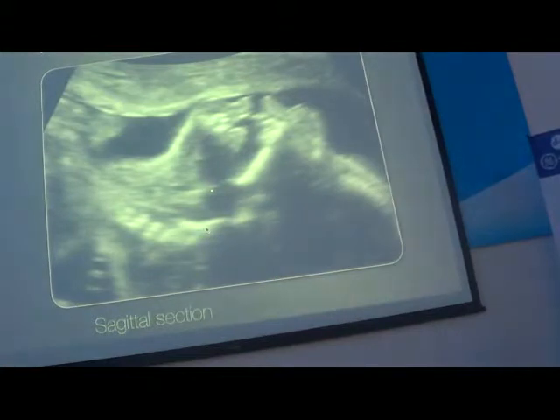So what you have to do, you have to put the head of the baby in this position. The head is on the back. And with the 2D, if you can see the palate like this, you can do a 3D volume and you can work with this volume.